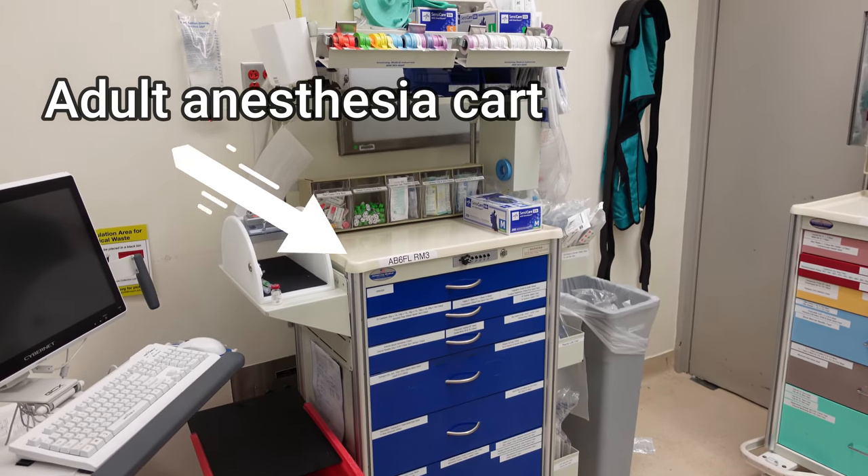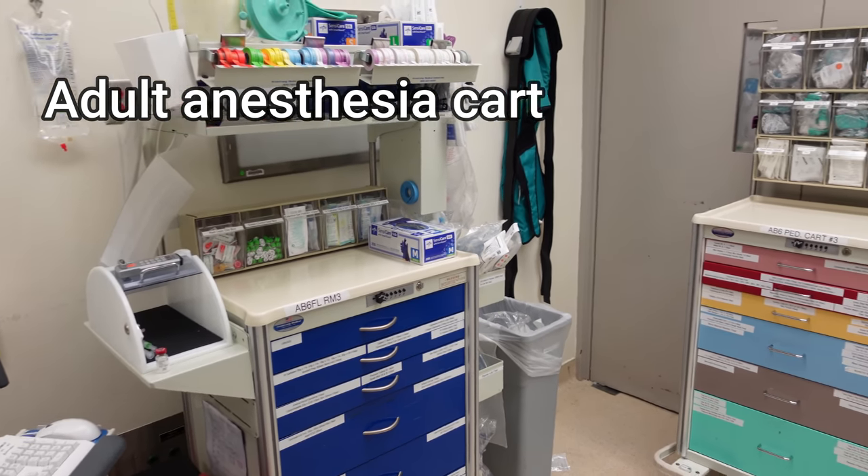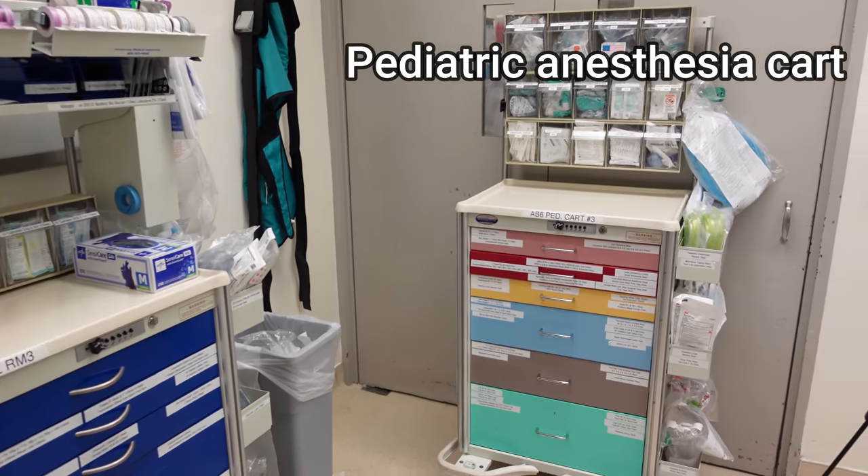The equipment used in pediatric anesthesia however is quite different from that of adult surgery, so there's actually a separate cart full of equipment that we use at our hospital, which is where I'm going to be getting all of the equipment from today. As I go through this video I'll show you a side-by-side comparison, because the size difference between the adult and pediatric equipment is quite striking.